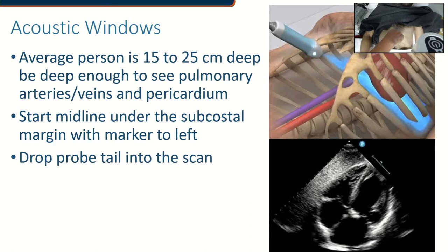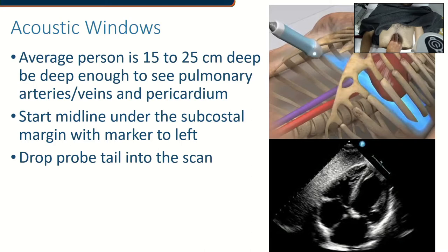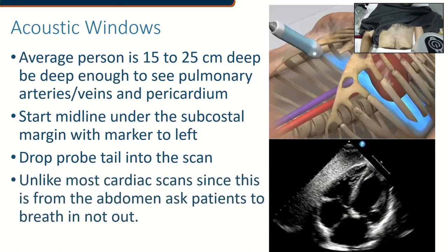We drop our probe into the scan — I like to start vertical because I know I have to drop into the scan to fan through the heart and up into the thorax. By dropping the tail of the probe, I'm shooting up toward the patient's head to scan the thorax. Unlike most other cardiac scans where we want the patient to breathe out to rid air artifacts, since we're scanning from the abdomen we actually want the patient to breathe in — not out — because that drops the diaphragm and brings the heart closer to our probe.